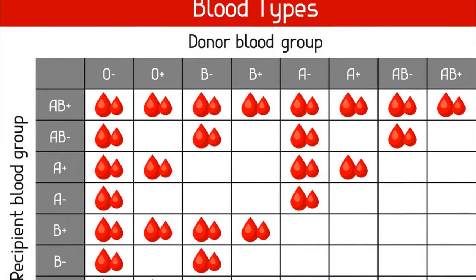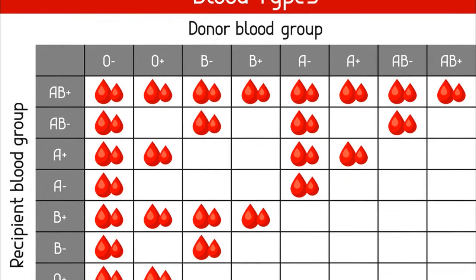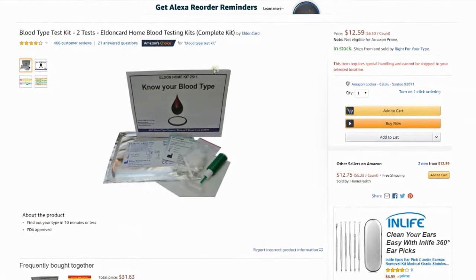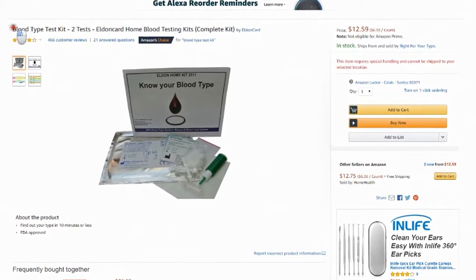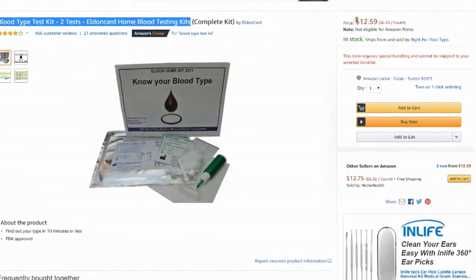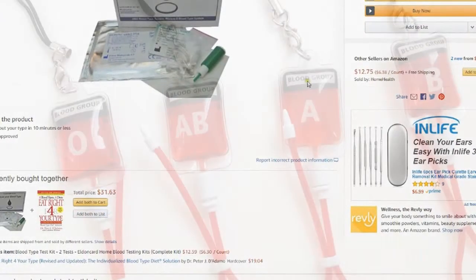Do you know your blood type? Would you like to know your blood type? It would be a good idea to know. The Eldon home kit is a self-test kit to determine your blood type inside the ABO and RHD blood group systems on an Eldon card with one test card.